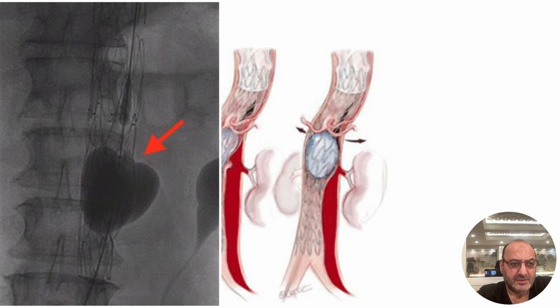This happened in a neighboring institution, and what you see, this balloon, to me, looks like a little bit of an aggressive balloon in here. You see the balloon outside of the stent area, as you see here. So that's too much balloon, and it appears that's not a non-compliant balloon. I'm sorry, it's a compliant balloon. With a compliant balloon, when you balloon too much, it will expand. The non-compliant balloon is more constrained, essentially.